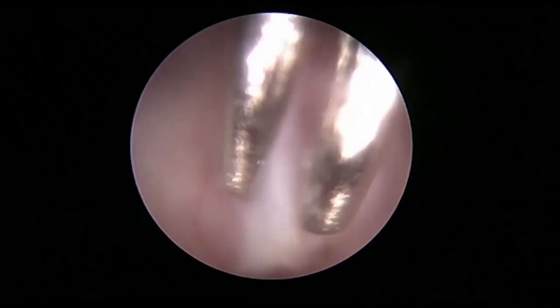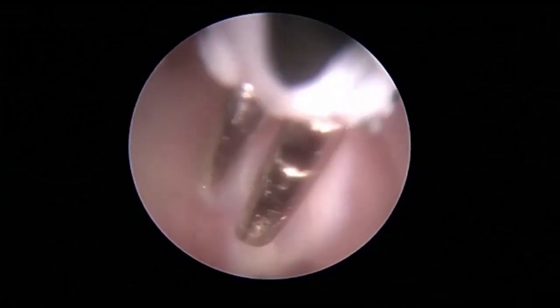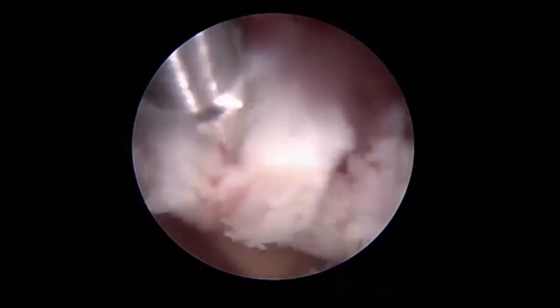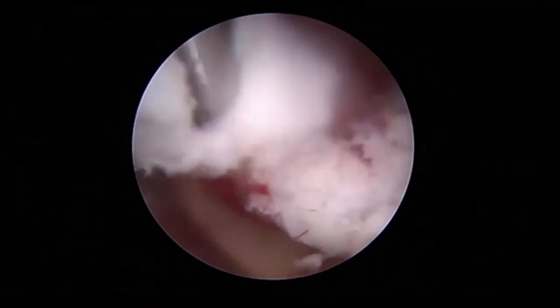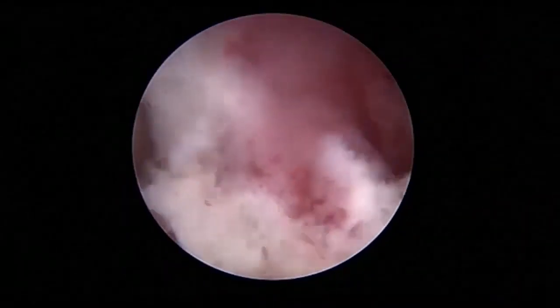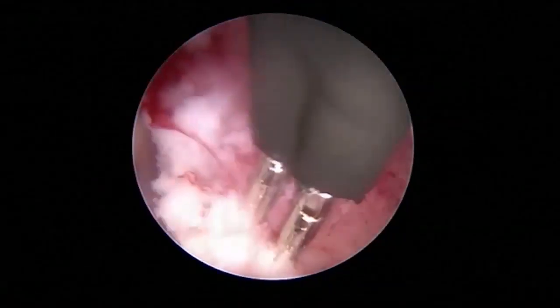The ventricles are not large here, so we're working within a small space. This is the grasping forceps, which rotates and then resects the tissue after it has been coagulated. You can see the vascular nature of the tumor, moderately vascular. So as we work and remove this in a piecemeal fashion endoscopically, we remove and then further bipolar, which shrinks the tumor and devascularizes it.